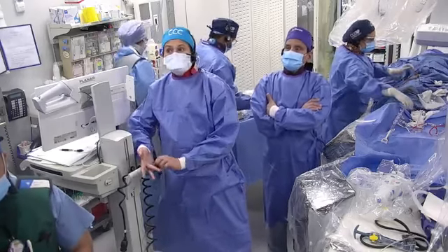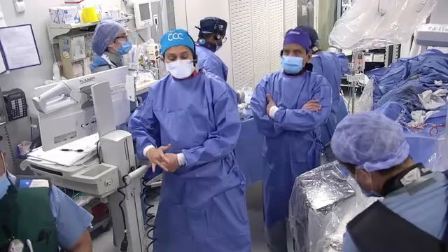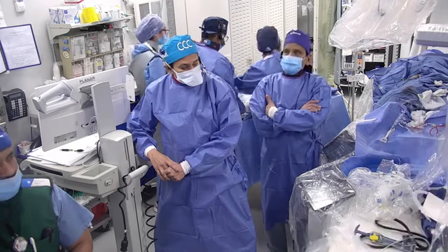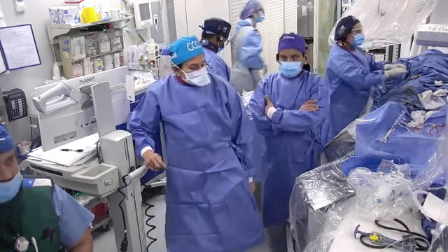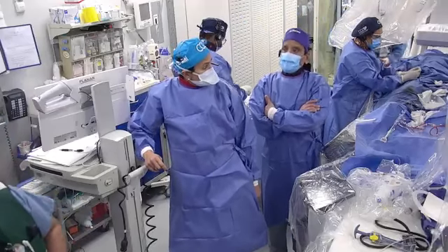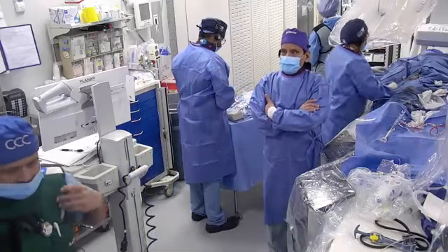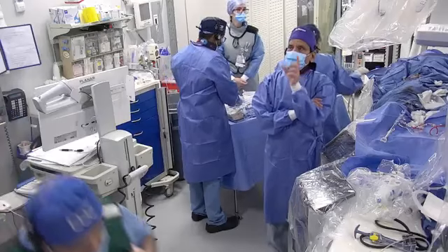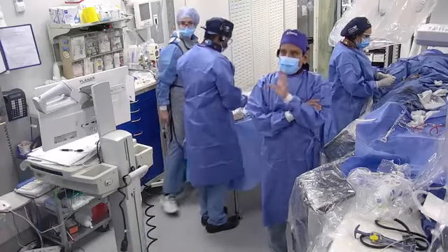Great. One extension of the same question: if you're going to use IVL somewhere in the ostial LAD or distal left main, don't you think it occludes for a longer duration to deliver therapy and then has more hemodynamic effect? I can tell you 100%. Three years ago, I was moderating a case in CRT. It was an 80% distal left main and 85% ostial LAD, ejection fraction 30%. And they wanted to do this case without balloon pump, without Impella.